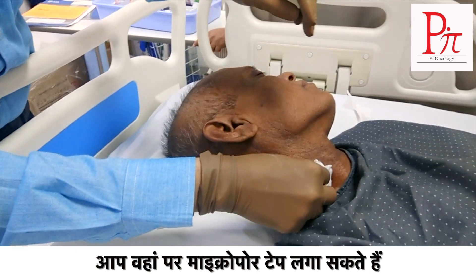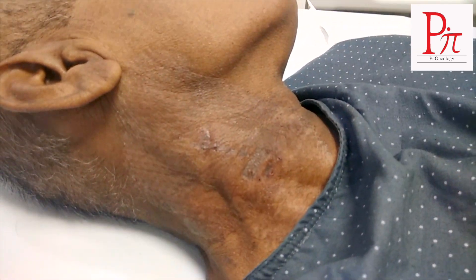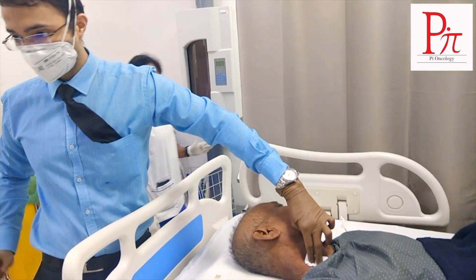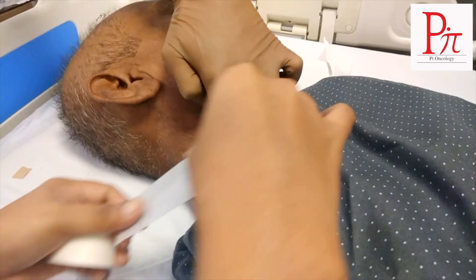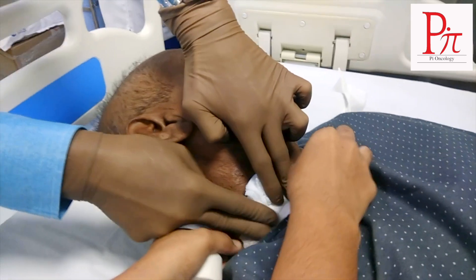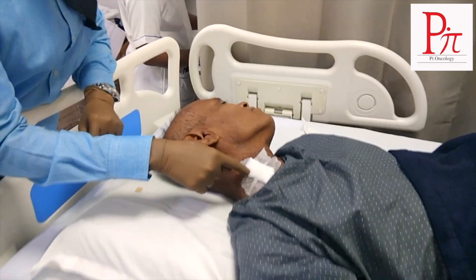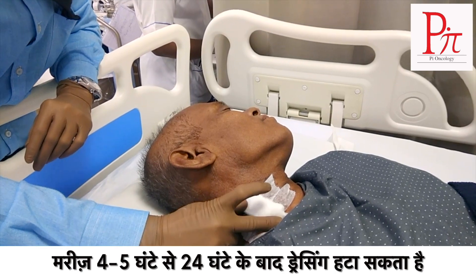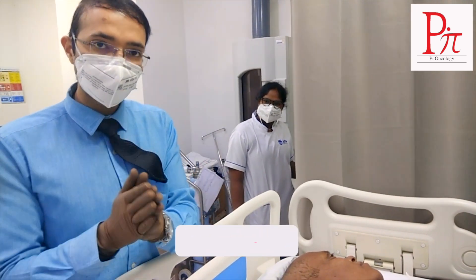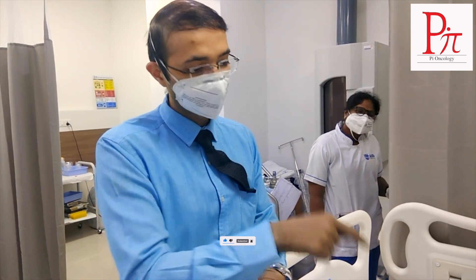And you can put a micropore tape, just a little bit of pressure and micropore tape. This dressing with slight pressure is good enough. The patient can remove the dressing after 4 to 5 hours, up to 24 hours, anytime during this time. So this is the procedure — any doctor, any nurse, all over who is seeing this video is, in my opinion, technologically equipped to remove the centerline. Thank you.